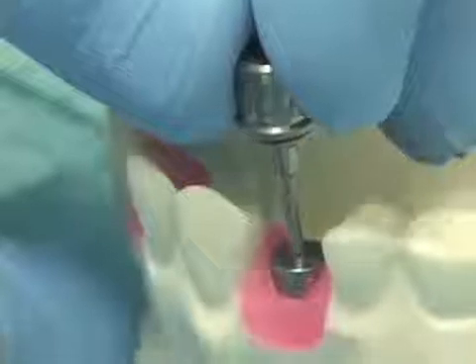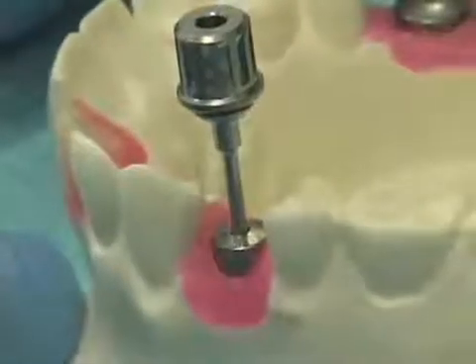Once that's been completed, the screwdriver fits into the end of our healing abutment, and we carefully just unscrew the healing abutment. And that will lift right away.